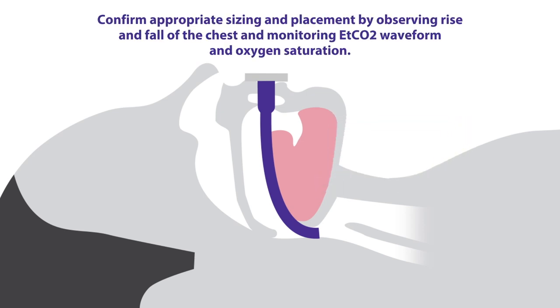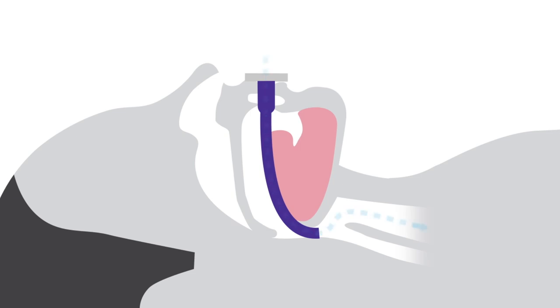Confirm appropriate sizing and placement by observing rise and fall of the chest and monitoring end-tidal CO2 waveform and oxygen saturation. If unable to maintain oxygen saturation, resort to other airway options. Remove the MEA only after the patient's bite has been released on the MEA.